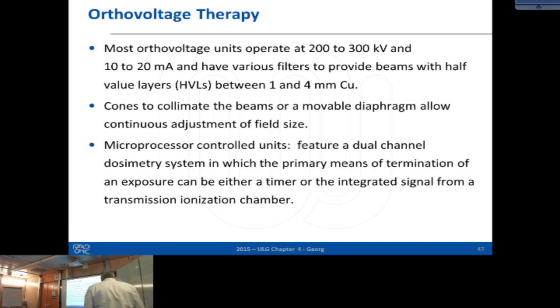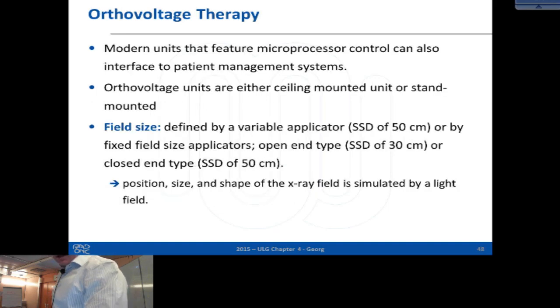also with these X-ray therapy units, we have the same principle in terms of verifying the delivered dose. In the older machines that we had 20 years ago, it was rather a timer-based system for delivering the beam. Here we have, in the more modern machines like the Gulmay system that you also saw, a transmission ionization chamber. It counts monitor units, and then you have this timer principle and this counting system with the primary monitor chamber and secondary monitor chamber, just like with the accelerators.